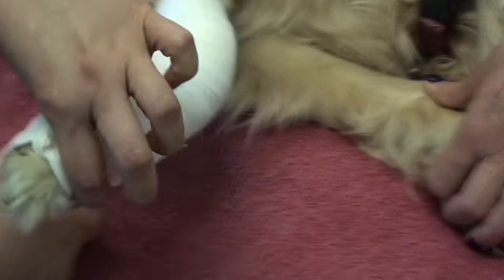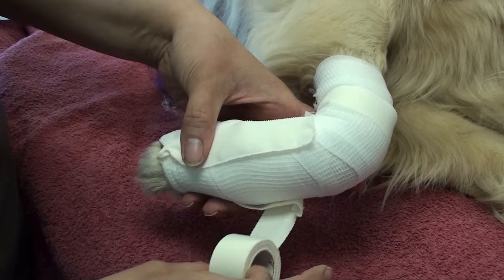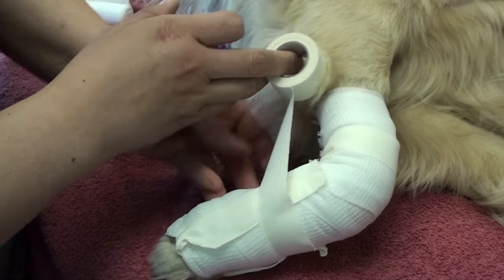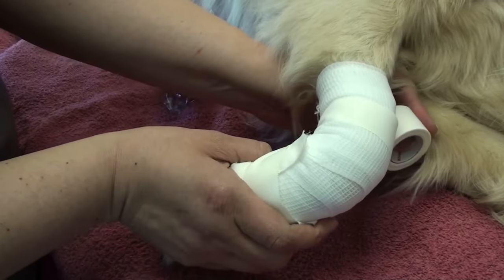She just created a loop to sling the radius. Notice how as she comes around in that figure 8 fashion, just like we did with the little dog, notice how she's starting close to the carpus.